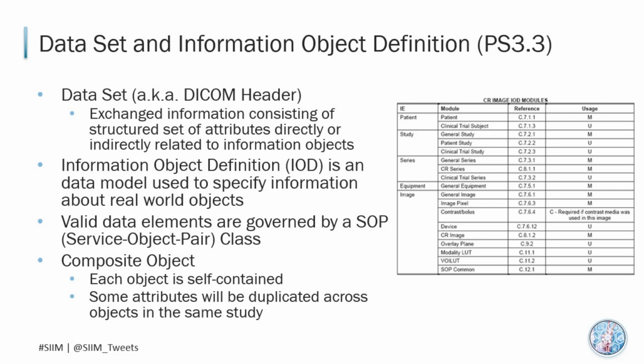Ah, that's interesting. I did find an advanced imaging study that had thousands of separate object files for just that one study. So it wasn't easy to recognize the common tags just by scrolling through the study's metadata. So can you walk me through an example in understanding the IOD?